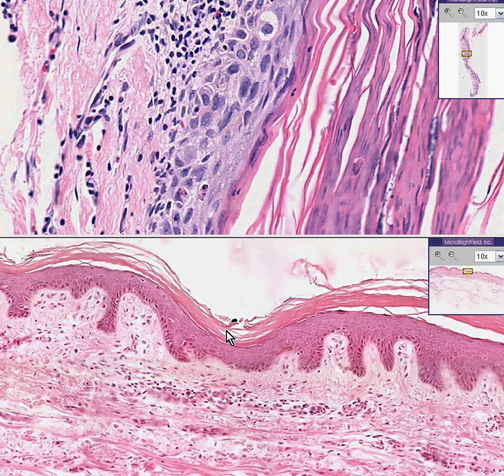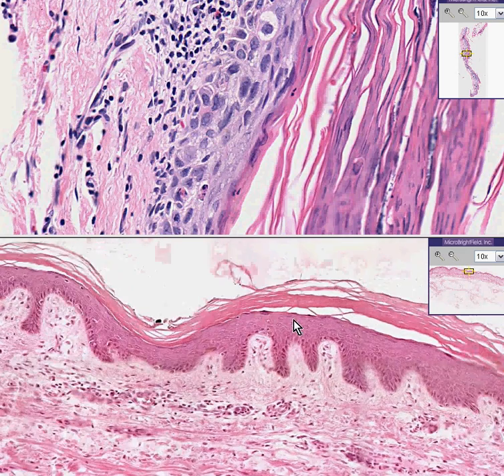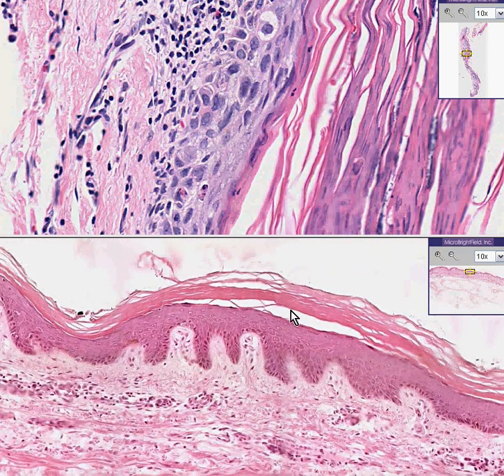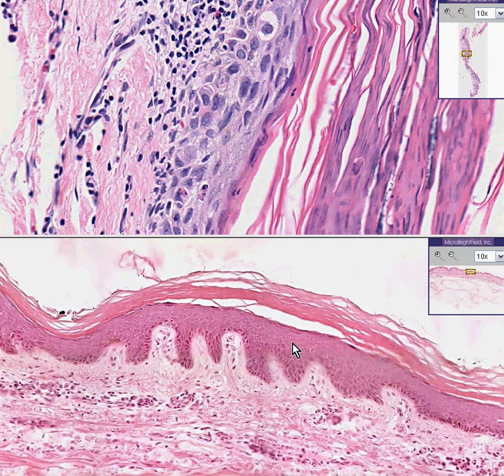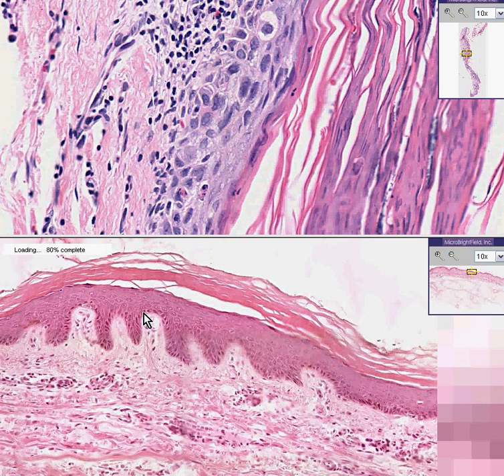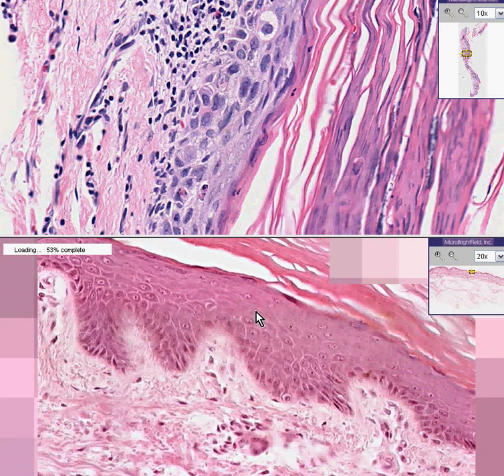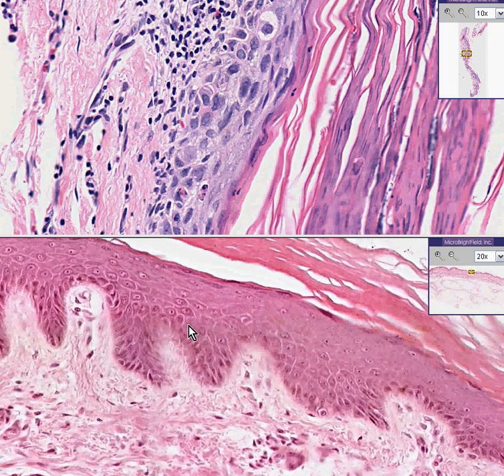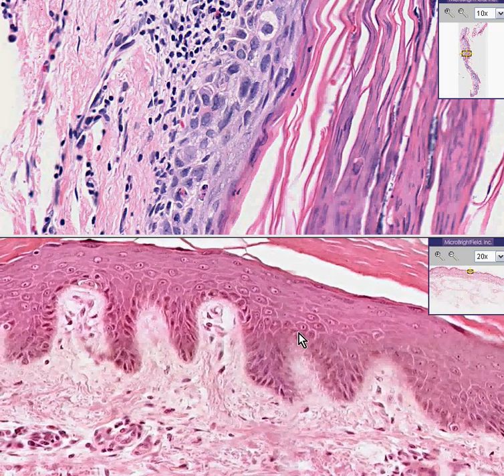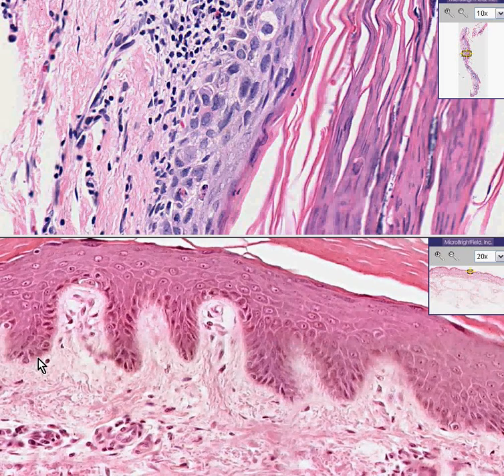Here is a textbook classical normal histologic section of skin on the bottom. This is regular skin — not thick skin, because the stratum corneum is generally thinner than the rest of the epidermis. Notice there is good maturation from the basal layers all the way up to the surface stratum corneum. You may occasionally find some pigmented cells stippled along the basal layer — if you look here, you can see some fine melanin granules.